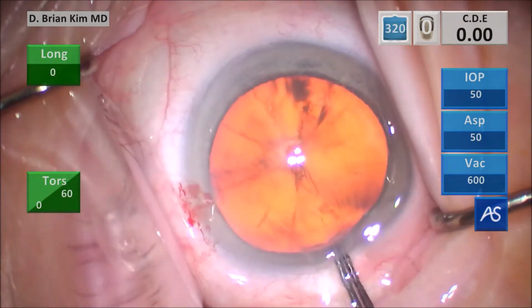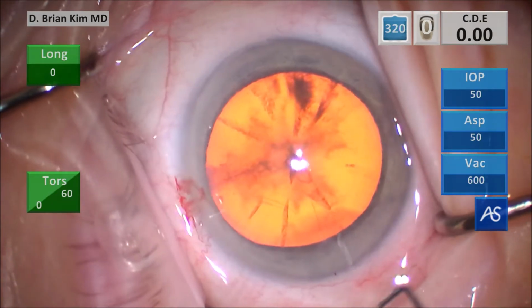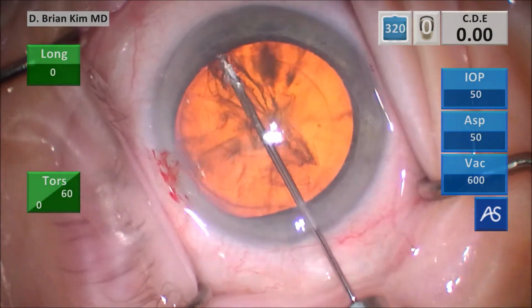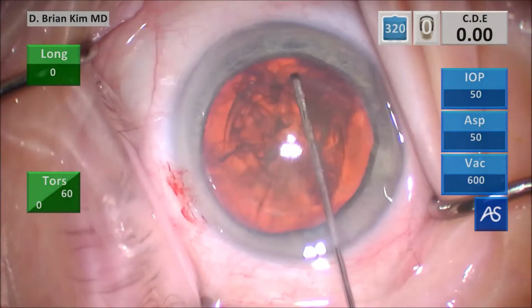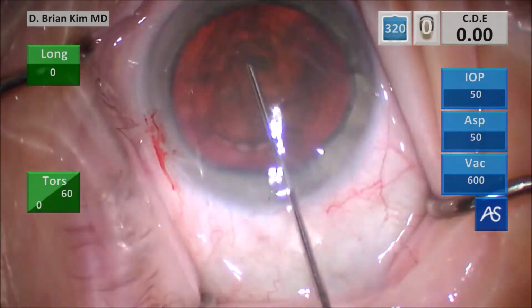Burp some viscoelastic out, and this is the capsular fornix hydrodissection technique. I place a cannula under the rhexis edge contra-incisionally, point it down, get a nice wave, rotate it back up, decompress the bag, point the tip down on the right side now. I try a little hydrodelineation there as well.